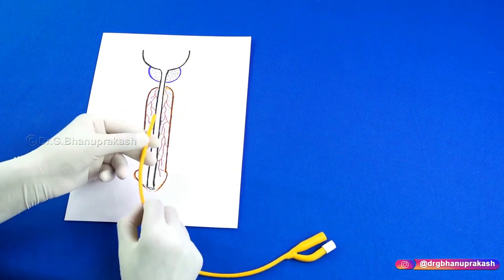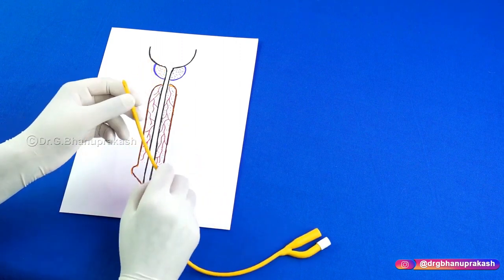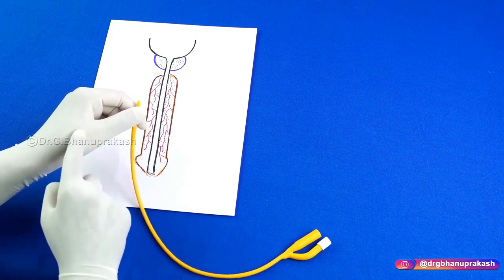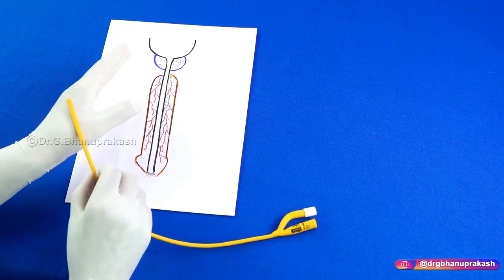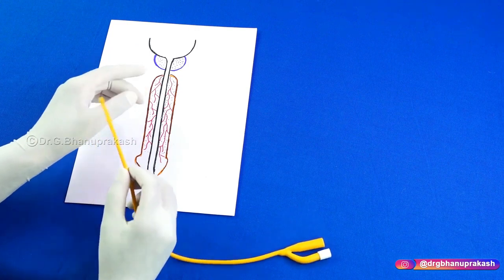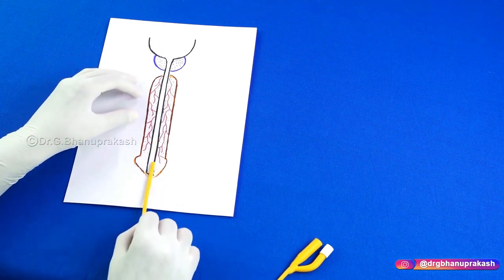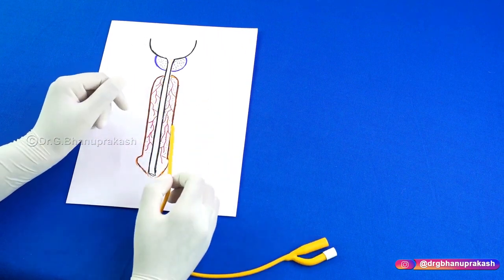Now, before you insert a Foley's catheter into the urethra till the bladder, the first thing you do is take lignocaine gel on your left hand. After taking this lignocaine gel, take the Foley's catheter and move it within the gel, so that while you are passing the catheter, the gel around it will be useful for easy lubrication and it can very easily pass into the urinary bladder.